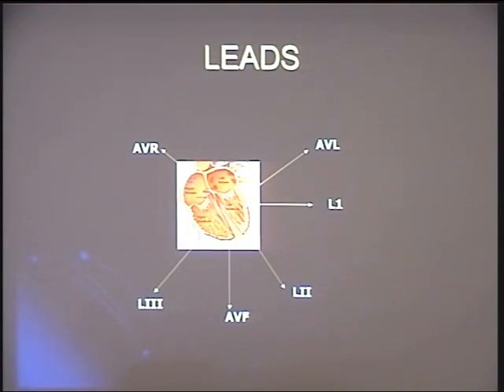Now this diagram I wanted you to remember once again. Frequently we will be showing this diagram. What I have done is I put the heart here and put the electrodes, and I am going to name each one of these electrodes by a specific name. You tell me now, my L1 is what lead? What direction was it recording? Horizontal. So lead 1 is a horizontal lead. Is that clear? It's a horizontal lead.